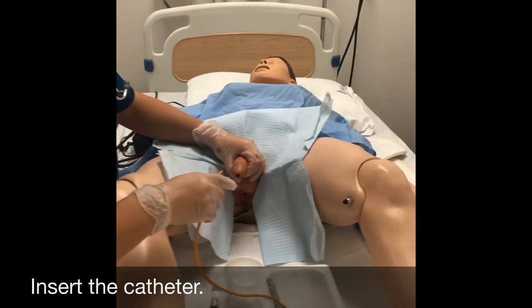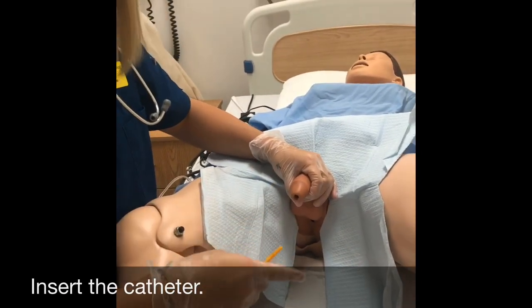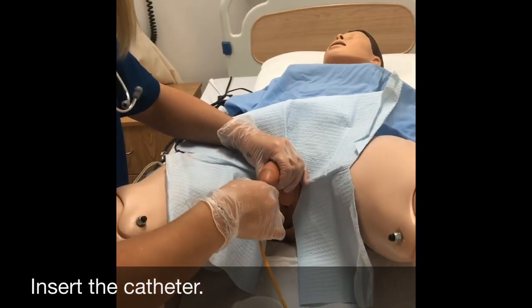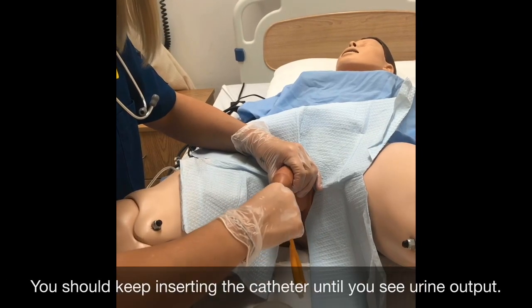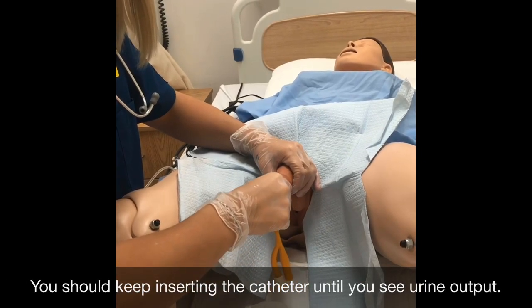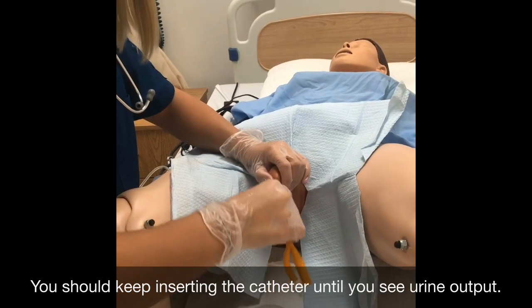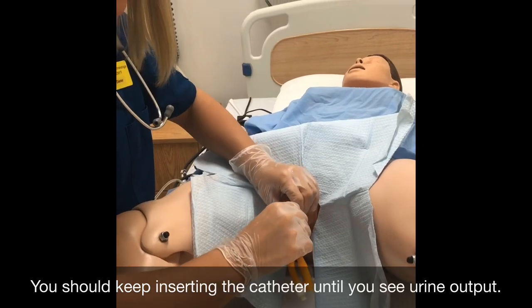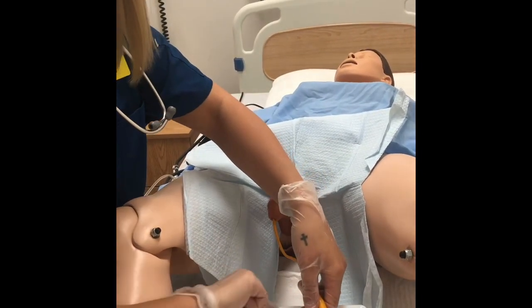And when I insert it, you're going to feel a little bit of pressure, so I'm going to ask you to take a deep breath, okay? In 3, 2, 1. And I'm just going to keep inserting the catheter until I see urine output. Perfect. Okay, so urine is flowing out of the catheter now.